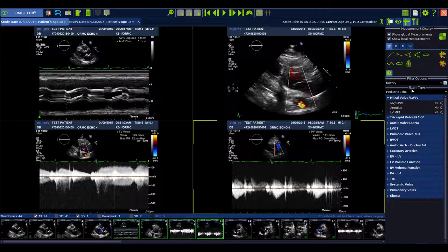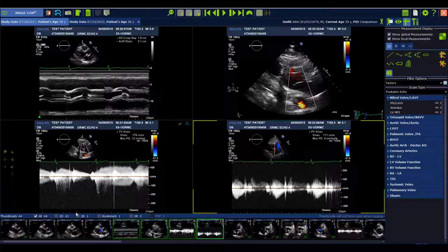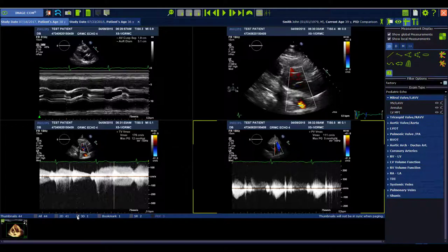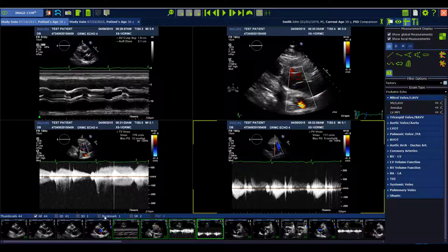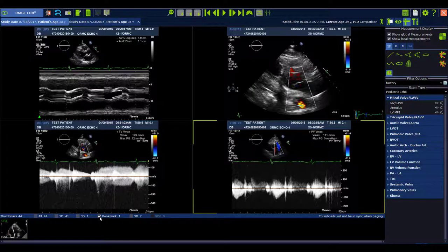In the thumbnail bar, you can also filter for different objects. At the moment you can see we selected all 2D images and also 3D images. You can filter, for example, just for 3D and then see just the 3D image. You can also filter for bookmarks.